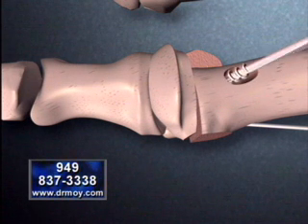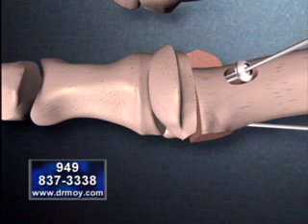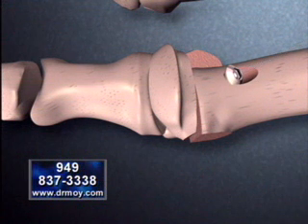The hollow screw is then placed over the guide pin and screwed securely into the bone. This technique provides the bone tremendous stability and allows for rapid bone healing.